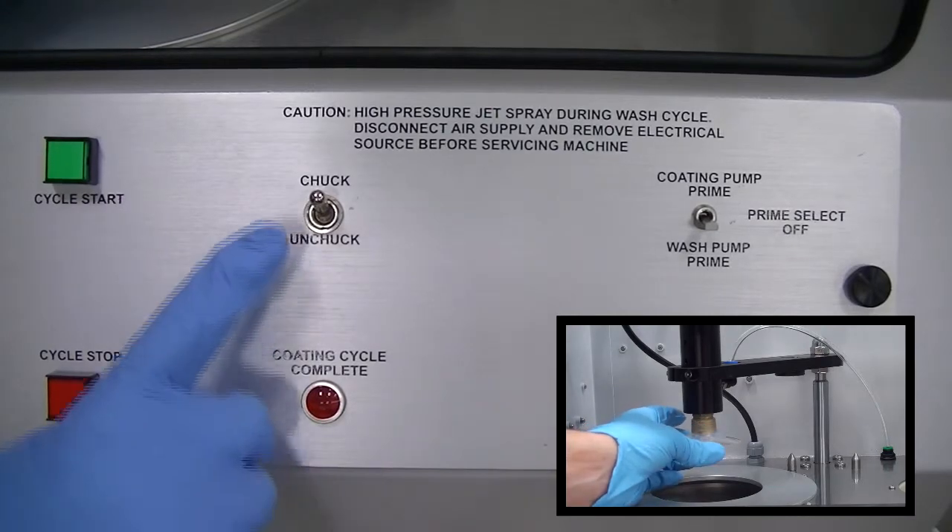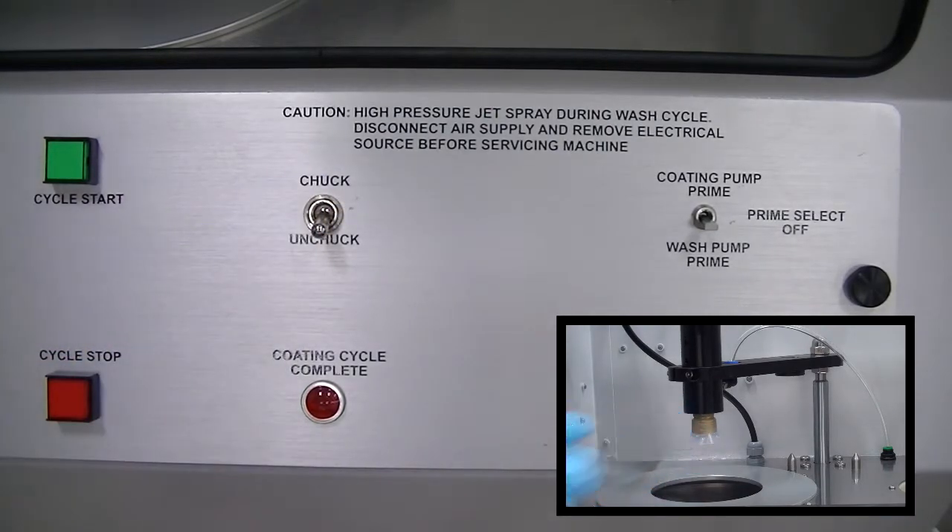Hold onto lens and flip chuck switch down to unchuck position. Flip prime switch to middle prime select off position.